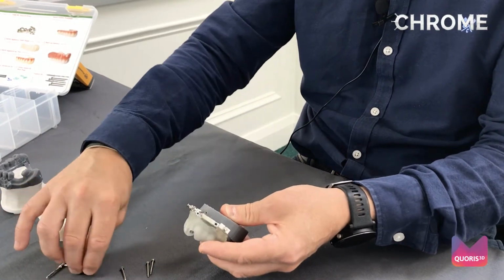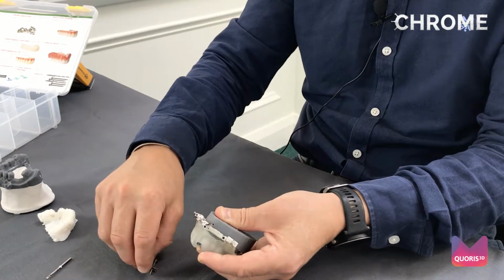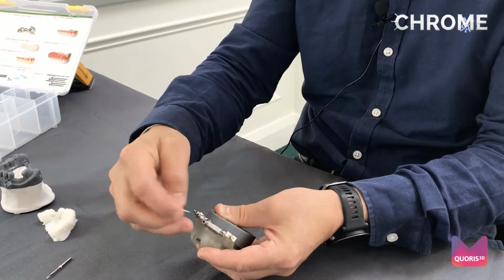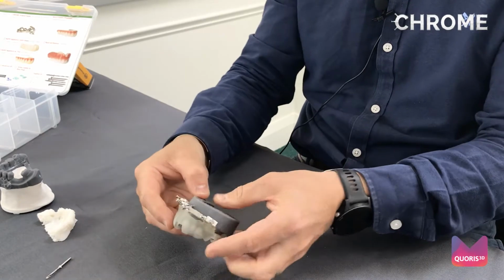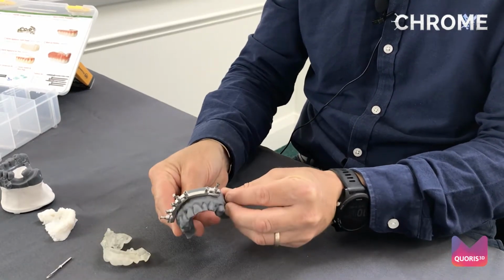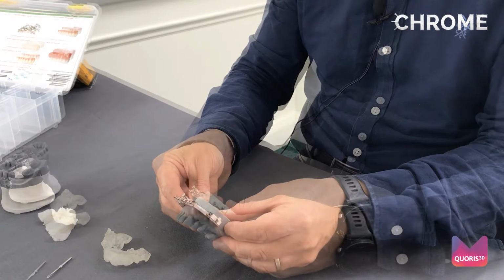Once that is done, you then place your fixation pins, and we recommend that these are tapped into place with a surgical mallet. You then undo your Swiss locks and you remove your pin guide. That's you then ready to go ahead, remove the teeth and do your bone reduction.